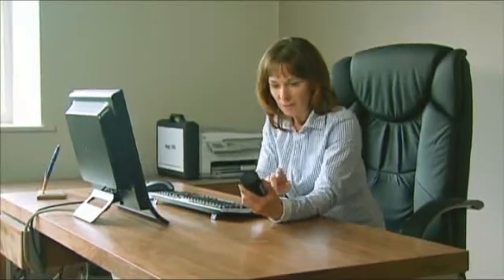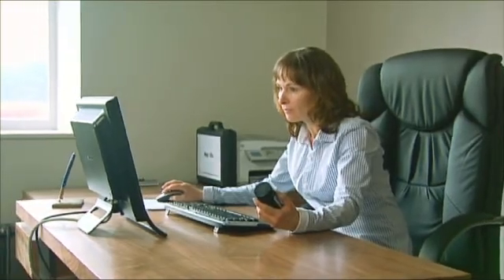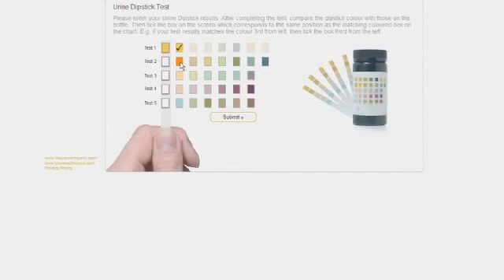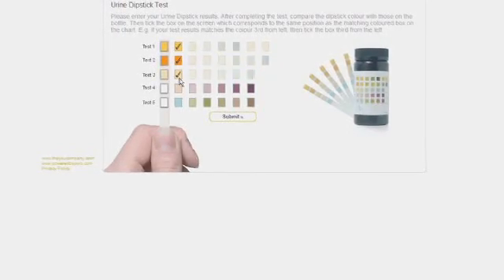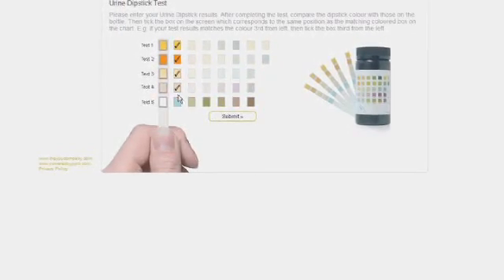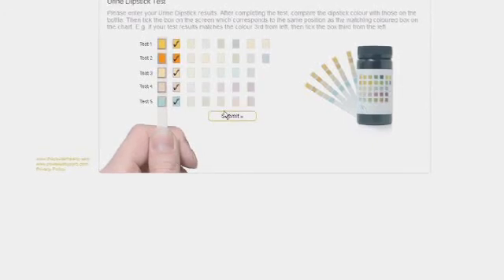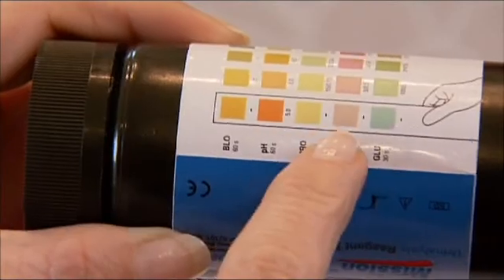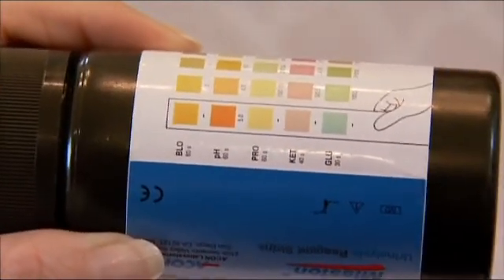Once you have your test results, it's time to enter them into your key to life. Click the colored boxes on screen that correspond to your chart results. If you spot a slight disparity between the two colors, click the box on screen in the corresponding chart position. Because the color reproduction on your computer monitor does vary, it's important that you don't rely on the on-screen image to judge your results — always use the chart on the container.